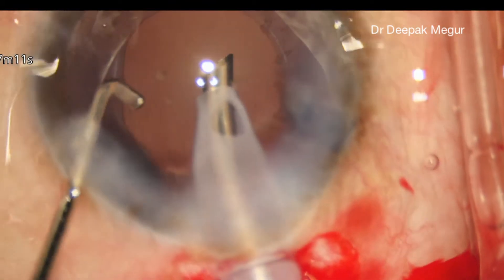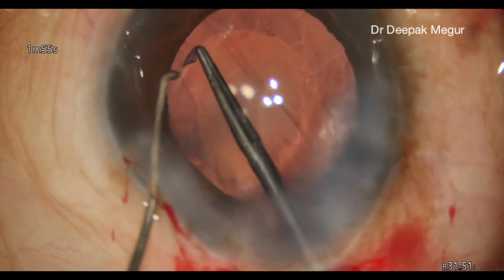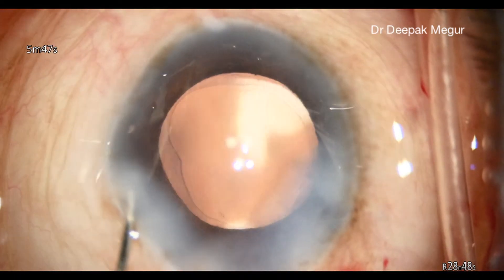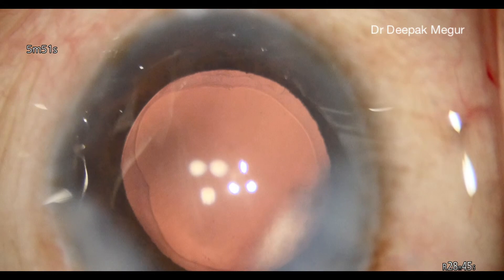Once the bag is clean of all the lens material, we inject the foldable lens and secondary enlargement of the rhexis is done to achieve an adequate size CCC.